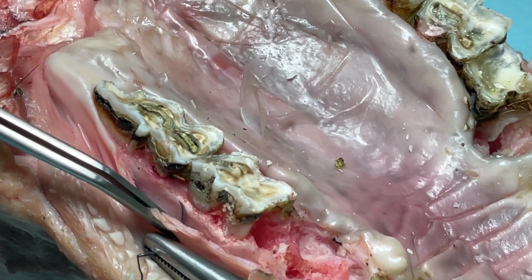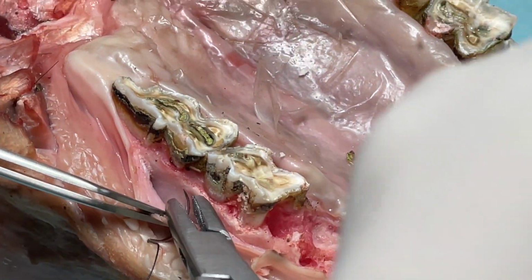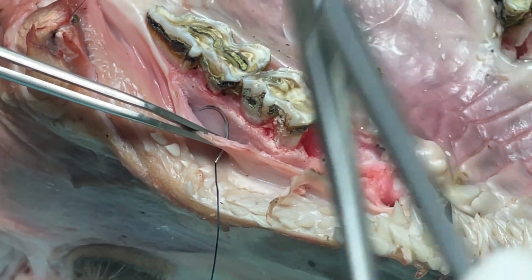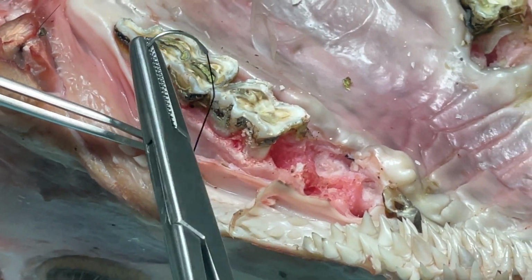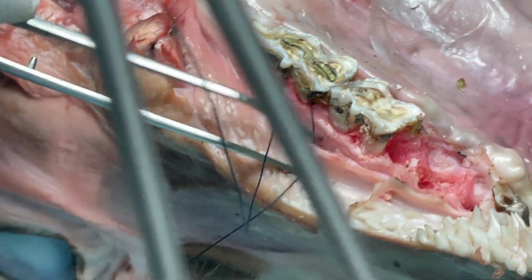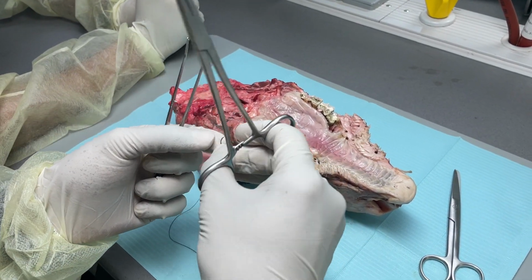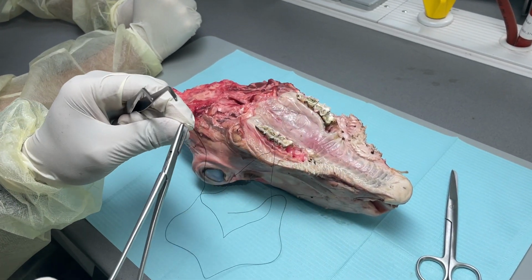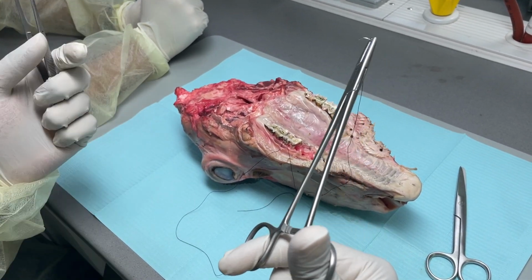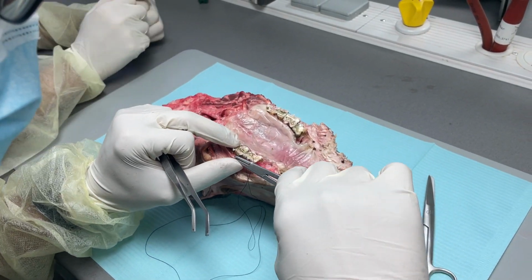Now I will release the lock. You can push it a little bit from here if you want to grasp it, and hold it. Then I want to move it interdentally between the two teeth. For this, if you want, you can lock, otherwise it is okay. And now will it come?